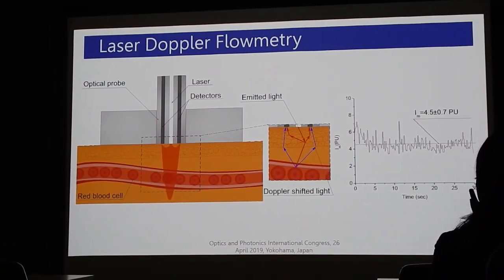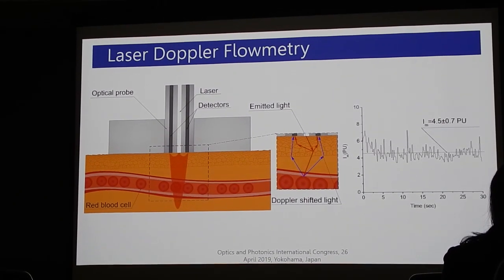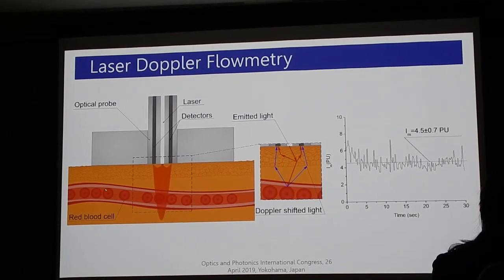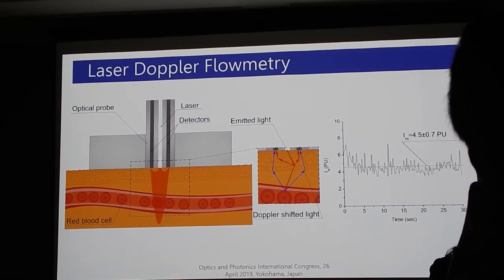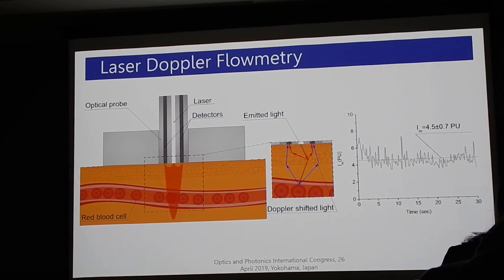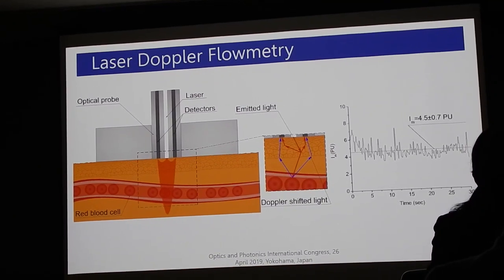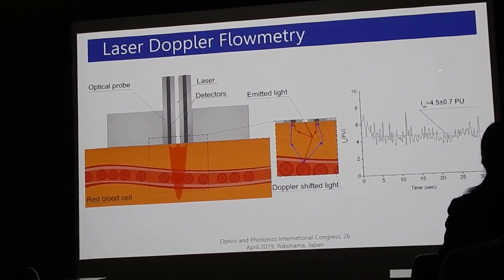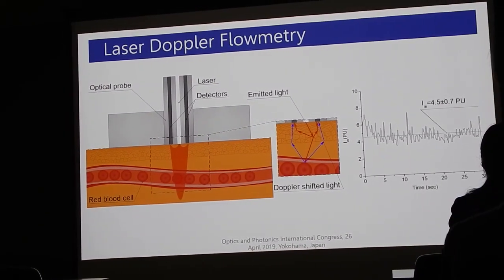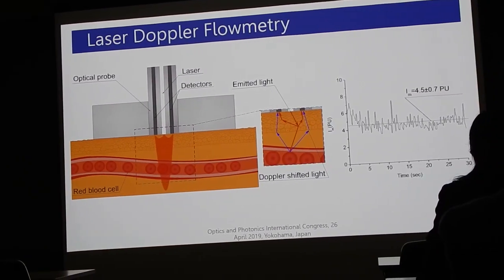Doppler Flowmetry is a non-invasive method to estimate the total local microcirculatory blood perfusion. It's based on the emission of a beam of laser light carried by optical fiber and the recording of the scattered light from moving red blood cells. The resulting signal is directly related to the number of red blood cells in the sampling volume and the velocity of their movements.